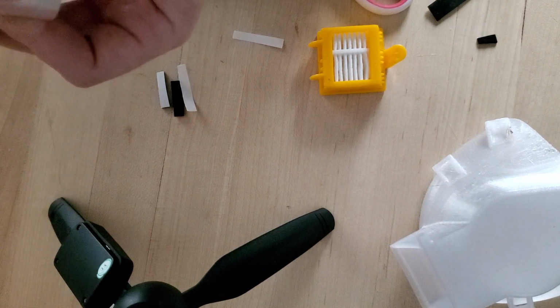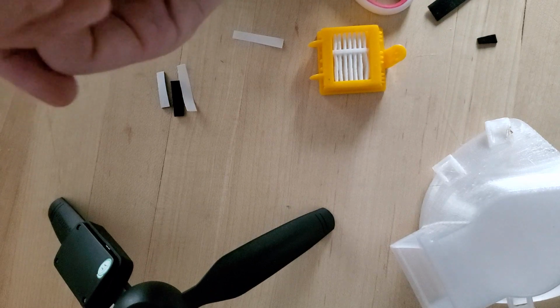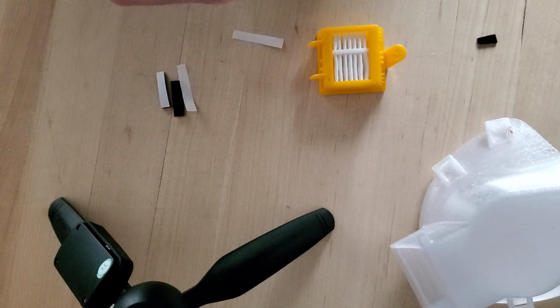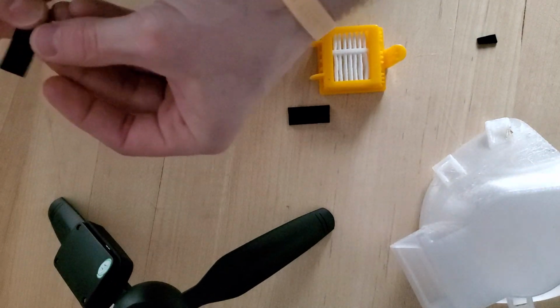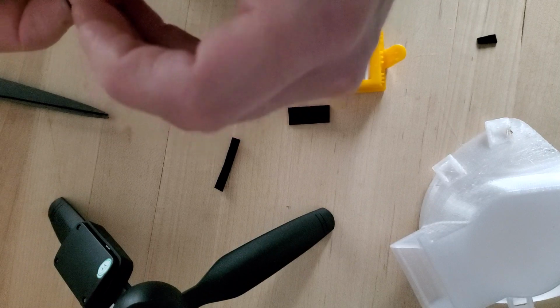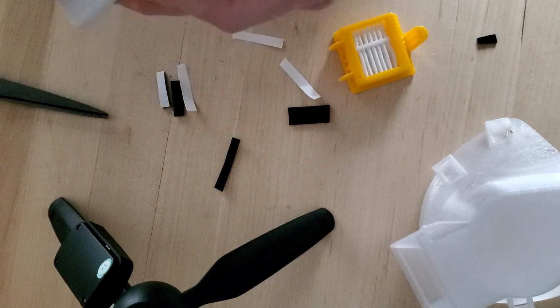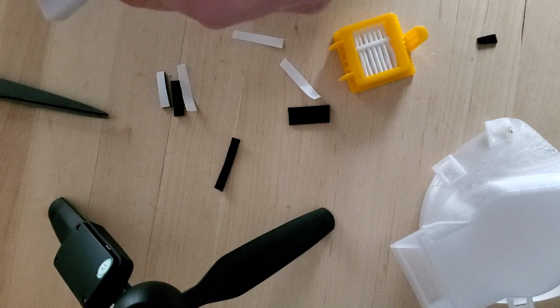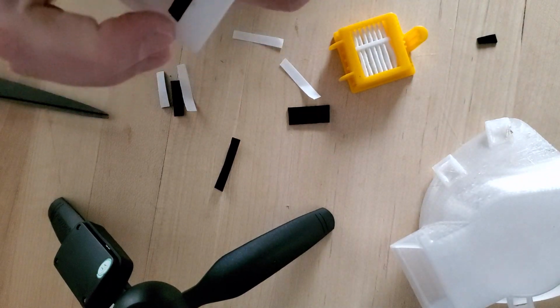It sticks really, really well, which is good, but it can also be problematic. I had this piece sitting out because I was going to make one for the mask. I still will, but I'll just cut out a piece for that. There is a little ridge right along here that you want to place up to it. You don't want to place on top of it.